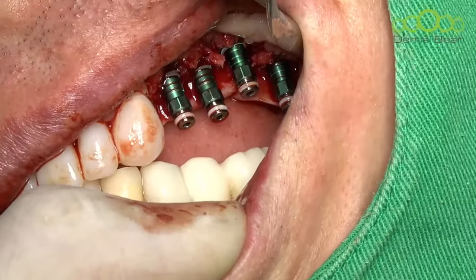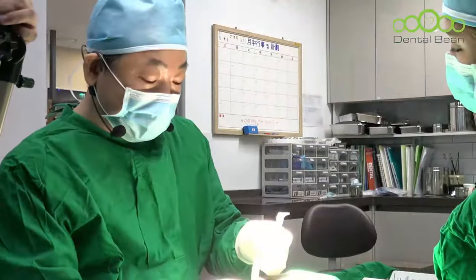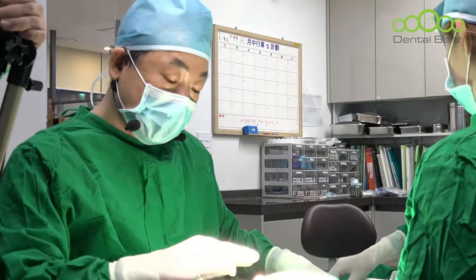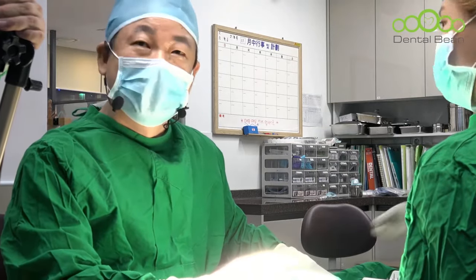Okay, let's control the depth of the implant. Start with the mount. No questions? Please check.